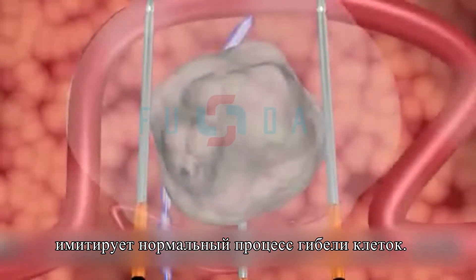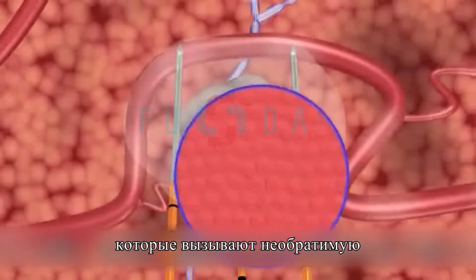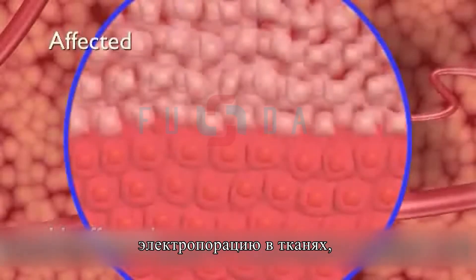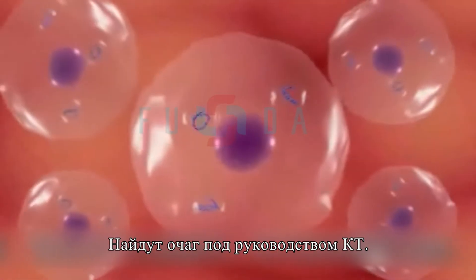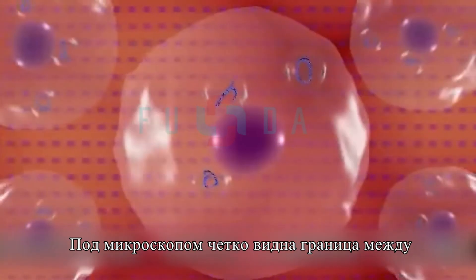After treatment, the ducts, blood vessels, and other collagenous tissues in the treated area remain viable. Microscopic imaging after treatment reveals a sharply delineated separation between affected and unaffected cells. At the cellular level, irreversible electroporation can be observed to cause cell death.